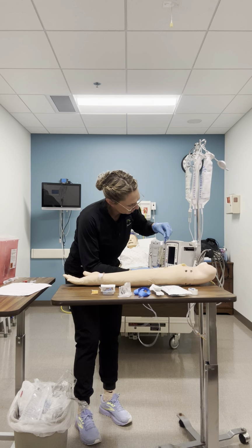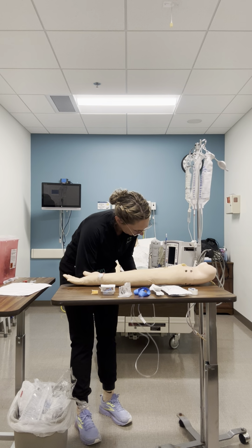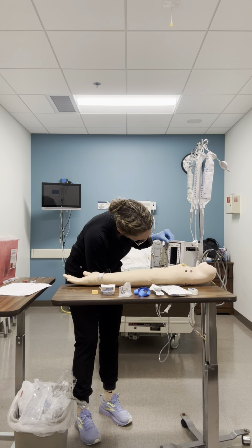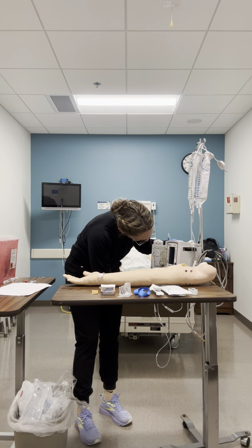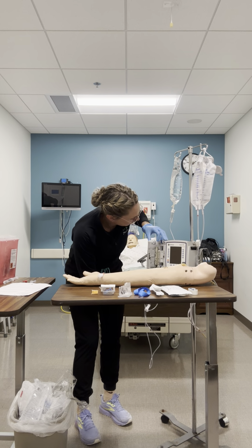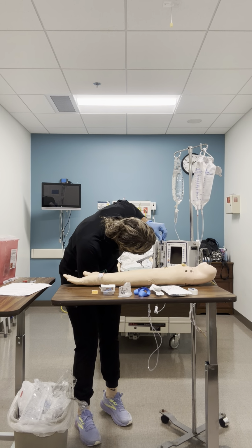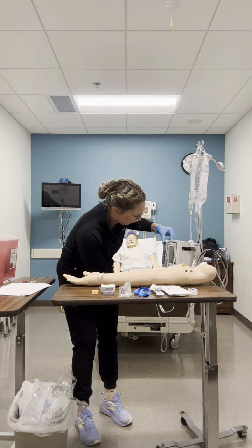Now we can put the tubing in place. So I'm gonna make sure my roller clamp is closed. Okay. There it goes.